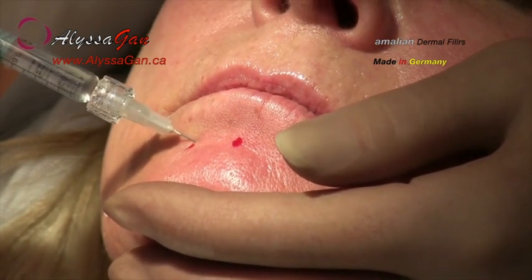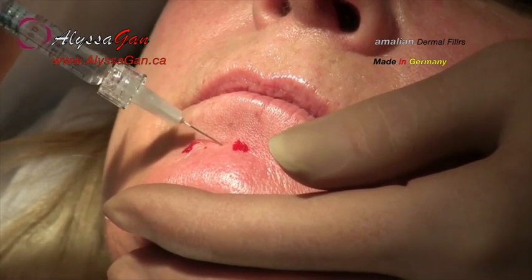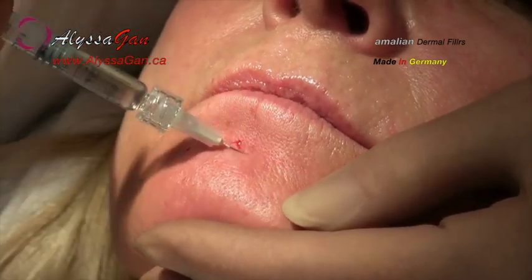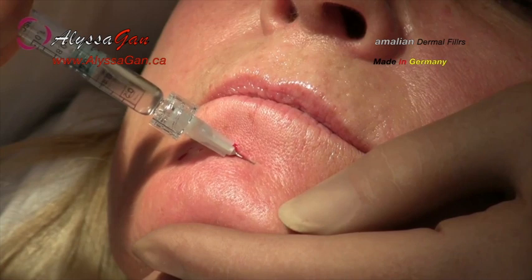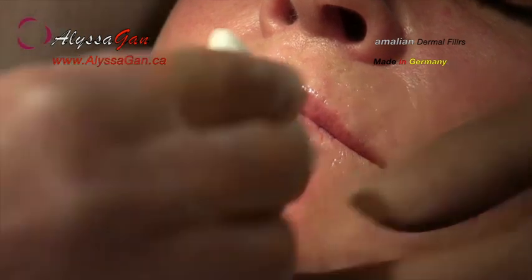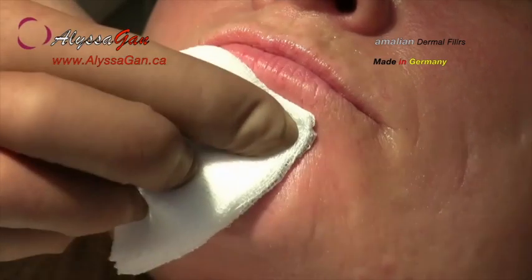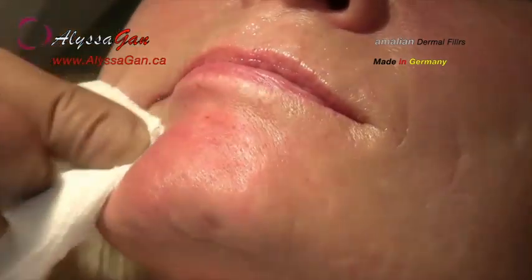Once this first, so to say, deep basic injection has been concluded, the superficial parts of the wrinkle are filled. This is done using both the punctual and the linear injection technique. This technique is also suitable for the treatment of very deep nasolabial folds. Also in this case, it's important not to overdo the massage, but to exert a gentle pressure instead, and to feel the implant to position it correctly. Again, cool packs should be applied at the end of treatment.